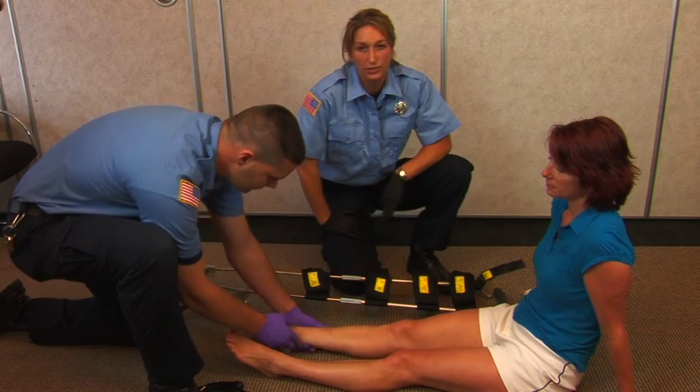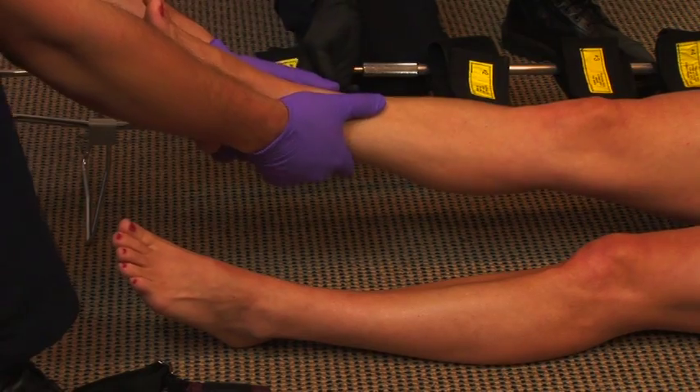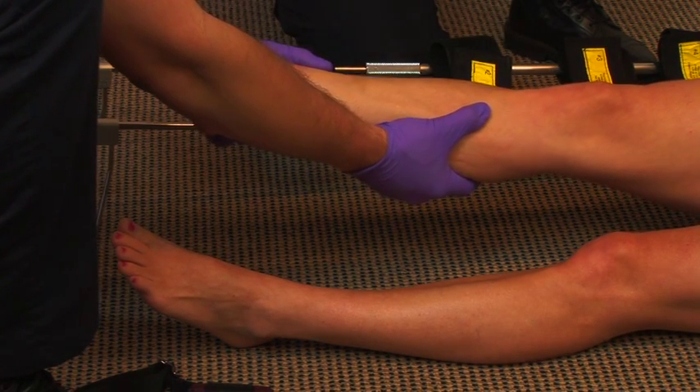Please don't apply manual traction if there is a lower leg injury suspected. My partner will hold above the ankle and below the knee and apply manual traction.